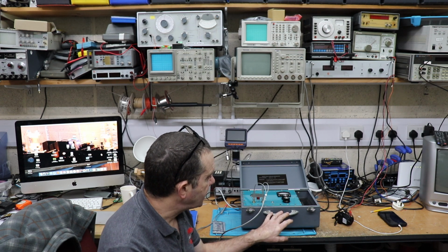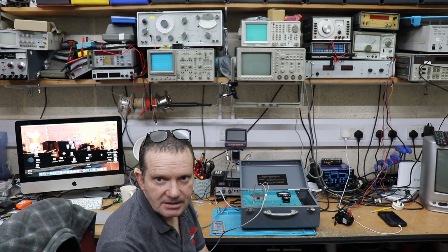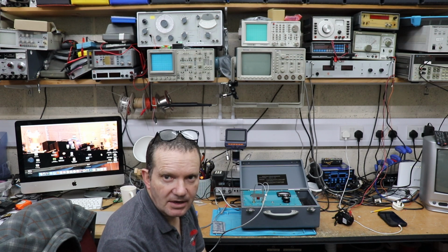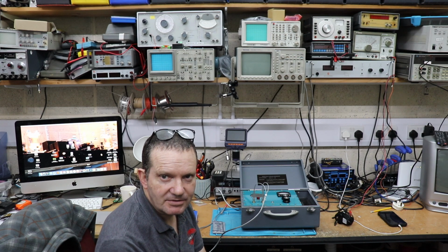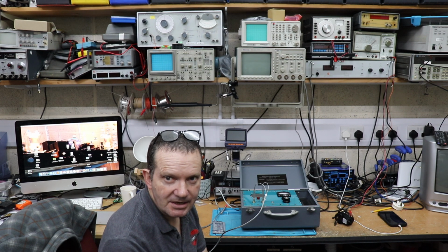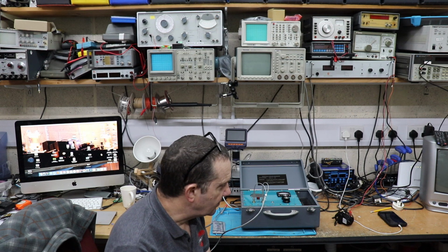And I would say a Doppler machine is very much like the equivalent of a multimeter that you would use in electronics. So it's quite a nice piece of diagnostic equipment. Whenever you think of medical electronics, you always think, oh, they're ever so complicated and really expensive. Well, I actually decided to see how hard it can be and build my own Doppler machine, which we'll have a quick look at. So what is it?